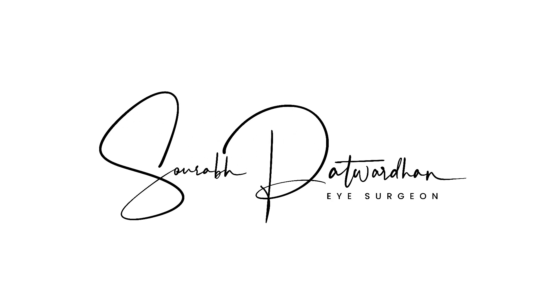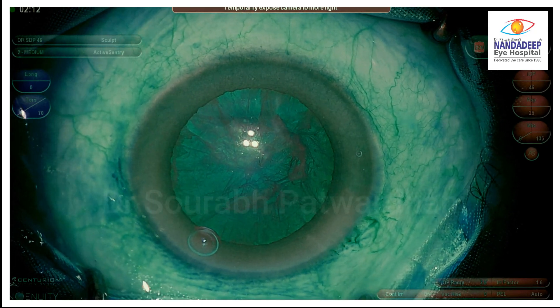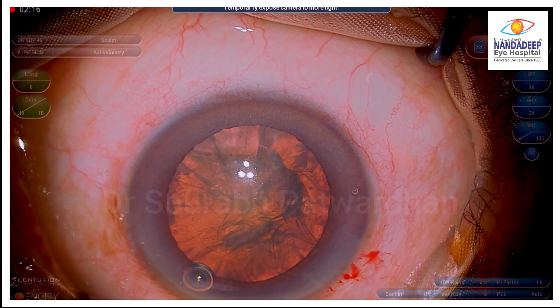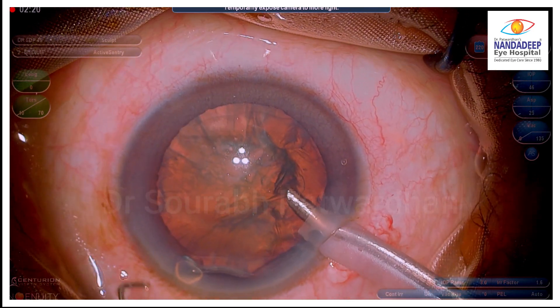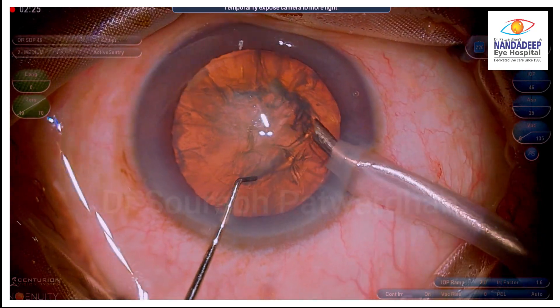This is another interesting video and I want you to do something after watching this video, so this is a challenge. I am going to show you a case where I am doing sculpting and we are going to magnify the video so as to see the intricacies of routine trenching that we are going to do in this particular video.